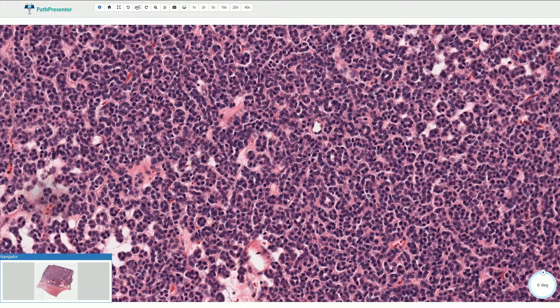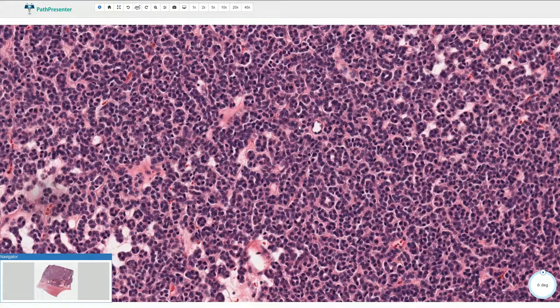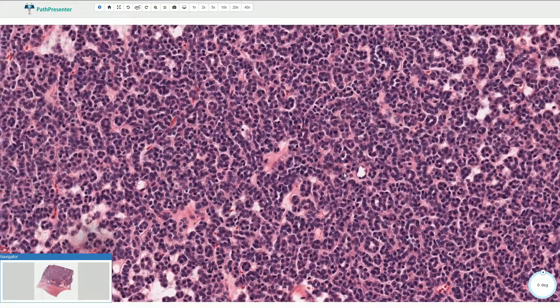The nuclei of the cells are very uniform, usually round to oval shaped. Sometimes we can see nuclear overlapping. Nucleoli are inconspicuous or not visible at all, and mitotic activity is very low.